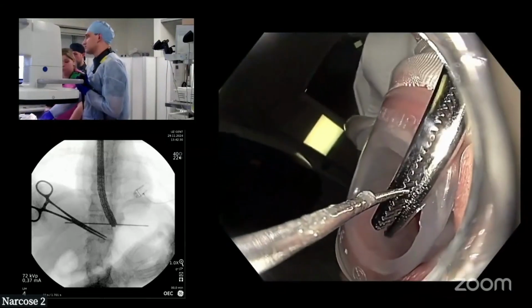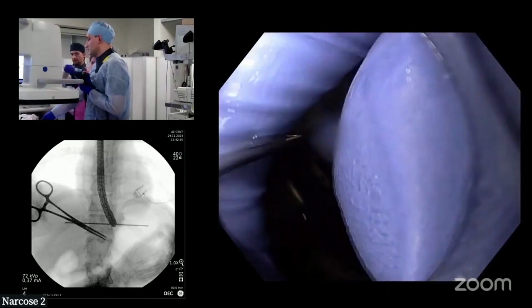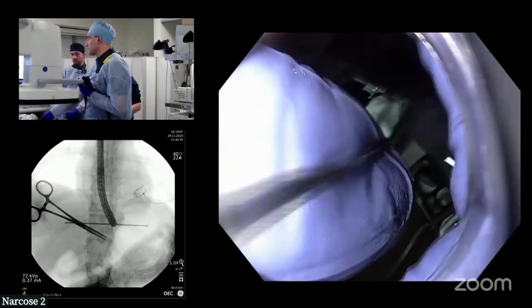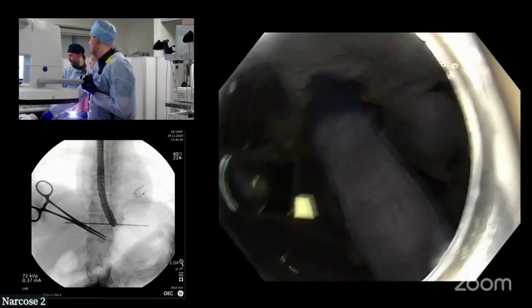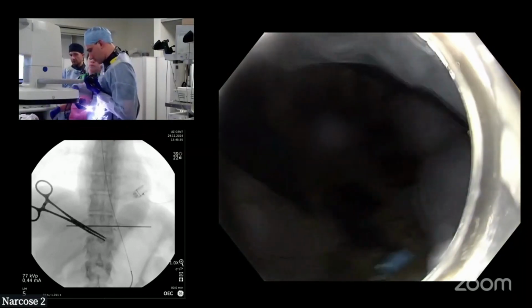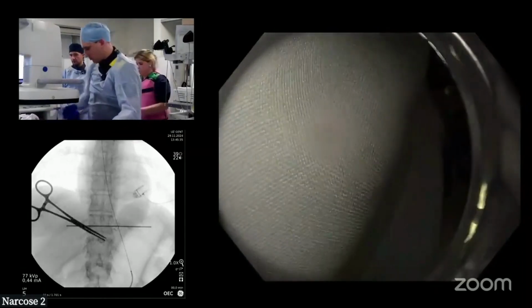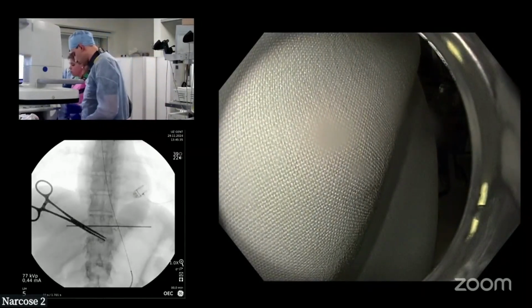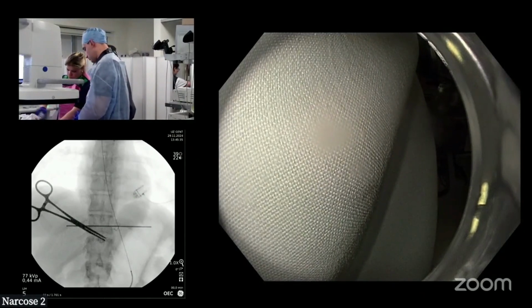So Jolien's all over this. She's already marked it with almost a forceps type thing, and Michele's now holding that. So we know the wire has not moved probably this time. And now let's check it with X-ray, one tap. Perfect. So much better than the previous time. Endoscope not necessary, so we remove the endoscope. And now, a fluoro predominant image would be great, please, because this is entirely dependent on the fluoroscopic image.